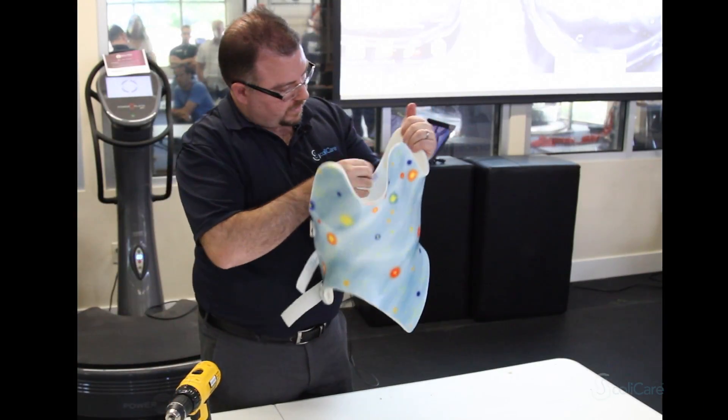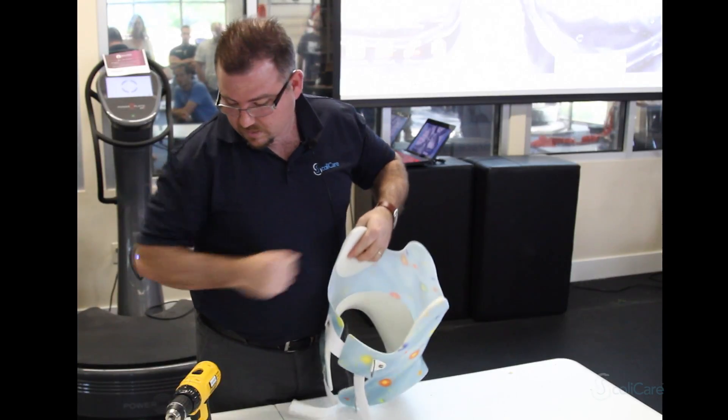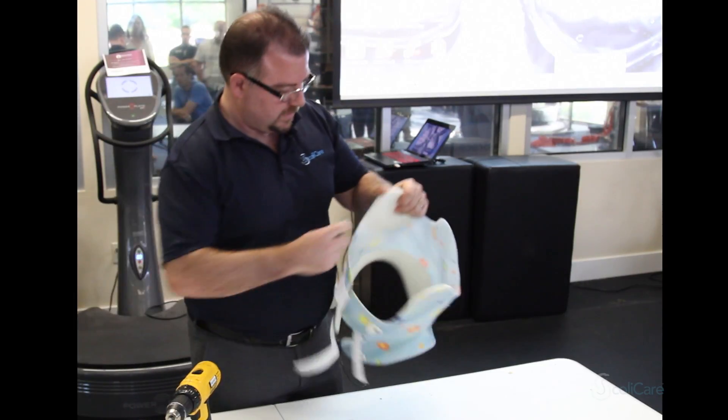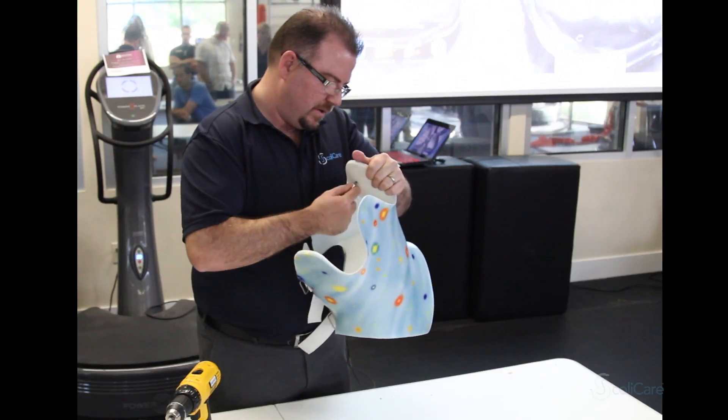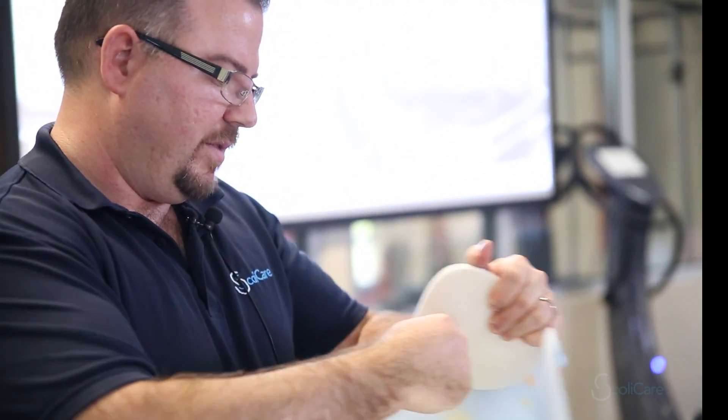We also want to make sure that we can see through the foam to put our bit in. We might just need to push it through with a screwdriver or clean it out with a knife, just so that the rivet can fit in.